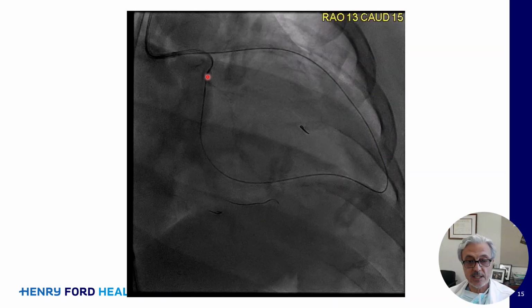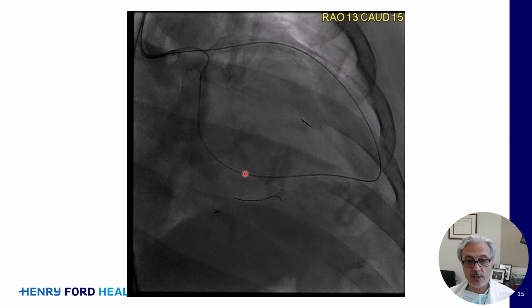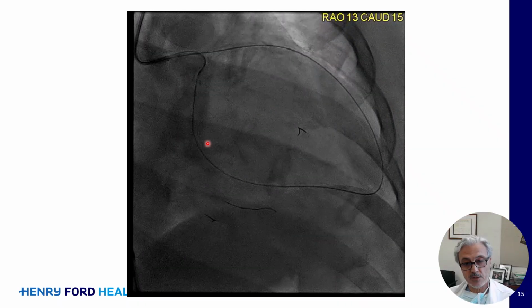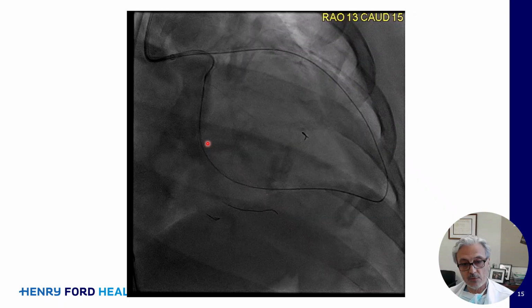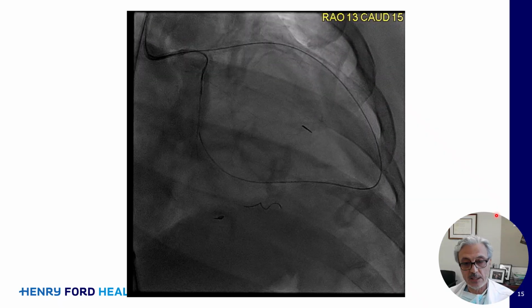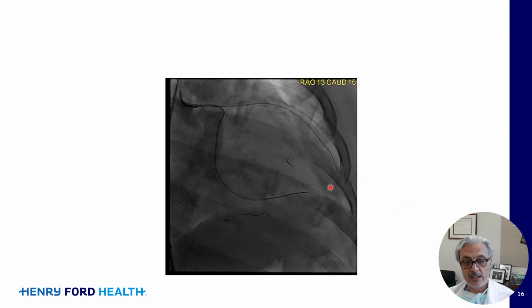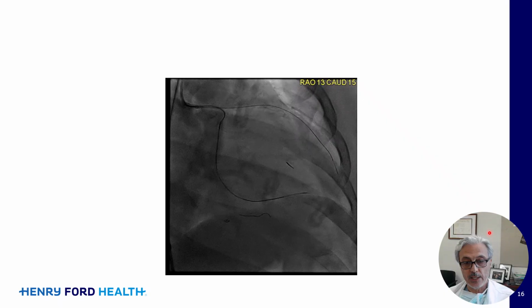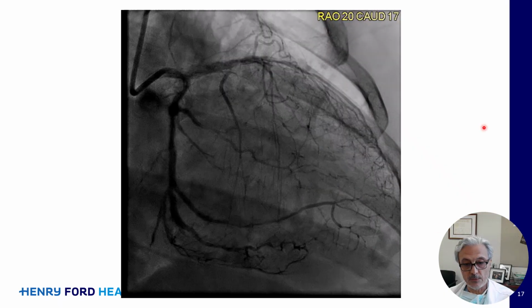So this is the antegrade microcatheter, this is the retrograde microcatheter. What you do is pull your retrograde microcatheter and advance your antegrade microcatheter. Be careful when you spin the Corsair, because you don't have a wire at the hub, it might coil. So make sure it stays straight. I'm advancing the antegrade microcatheter and at the same time pulling the retrograde microcatheter. Here we pulled the wire and wired antegradely, and now we don't have to worry about the retrograde wire anymore. We took it out.